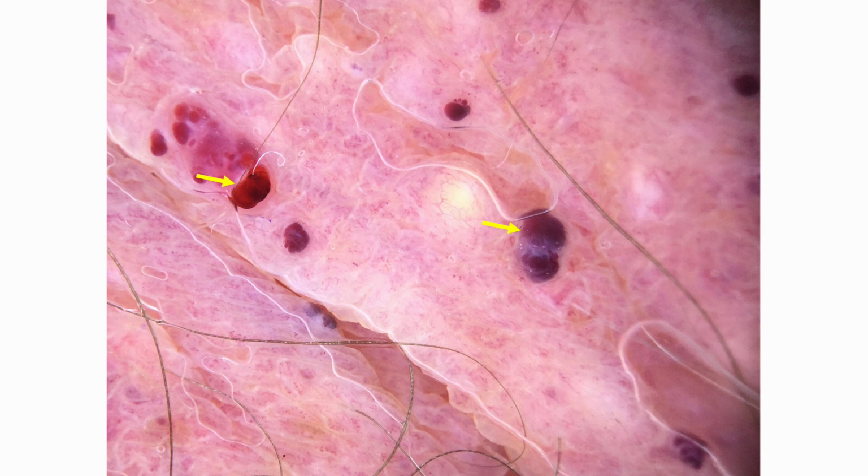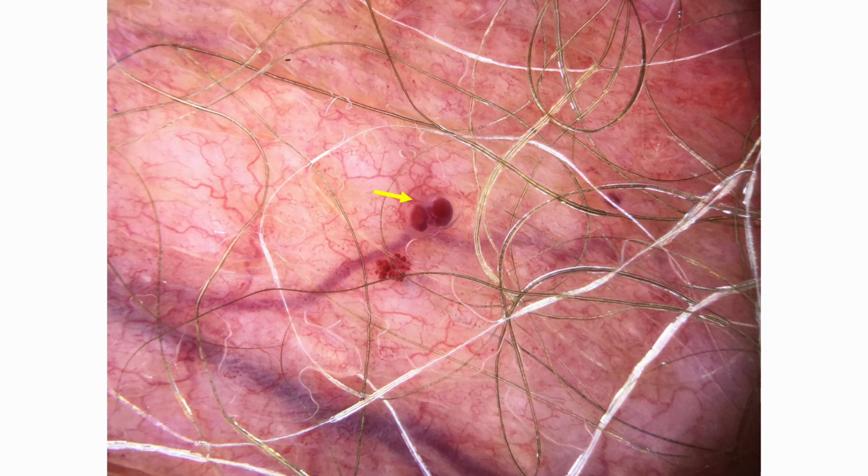Let's see this close-up for the same lesions here on the scrotum, and on dermoscopy you have the same. The presence of purple lacunae, dark lacunae, plus whitish veils, but also you can have all of the classic red lacunae. So this is a spectrum of disease, right? Angiokeratomas can have purple, red, and whitish veil. One more example where you see this red lacunae on the scrotum.